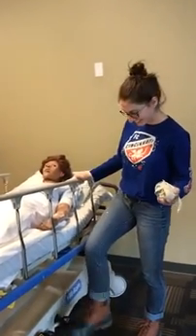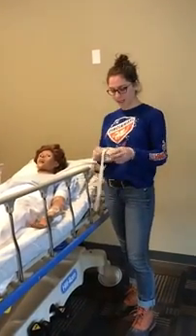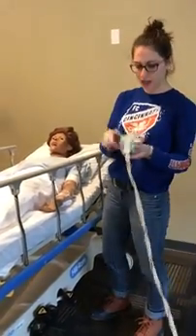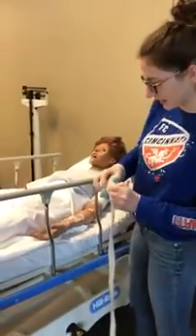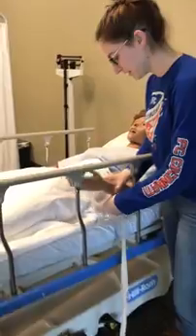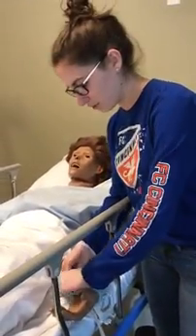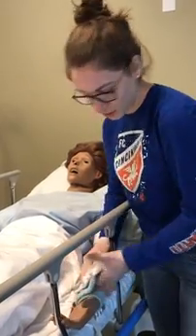Let's see if it's okay. So I'll take the restraints and unwind it, and basically it's like a clip and Velcro. So I would put on a wrist. So the doctor just ordered to do wrist restraints, and we only have one available, so I'm just demonstrating on one wrist, but you do the same thing to the other.